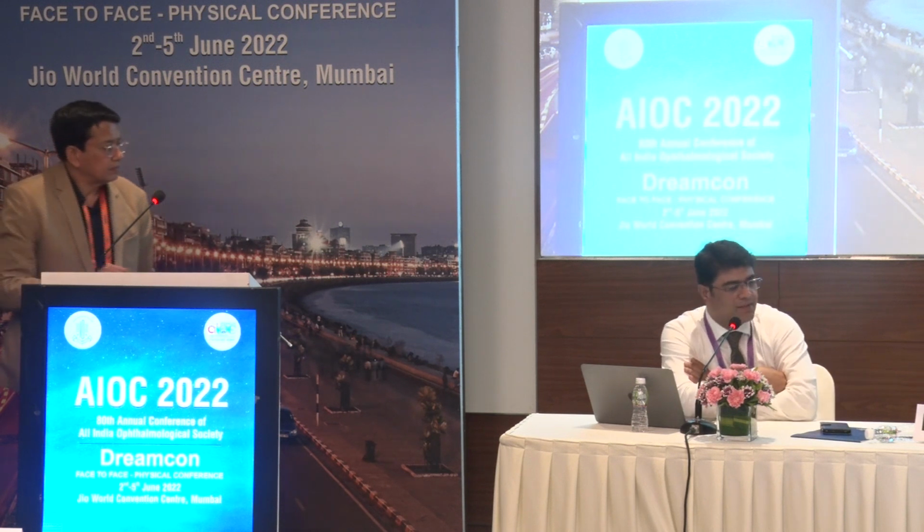Yeah. And there was a recent paper from Savini in which he showed that even the total corneal refractive power, compared with the Barrett Toric, had similar results. That's correct. So I think Barrett Toric, as you also mentioned, it's an amazing formula and it's very nice. Yeah. Absolutely.